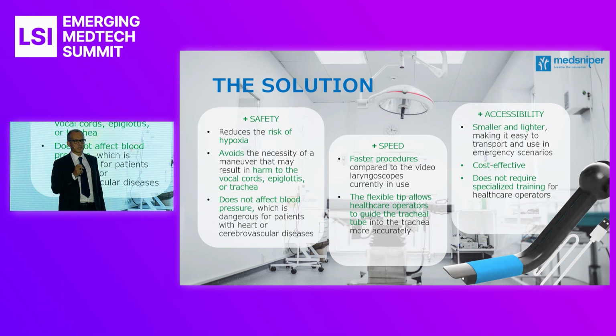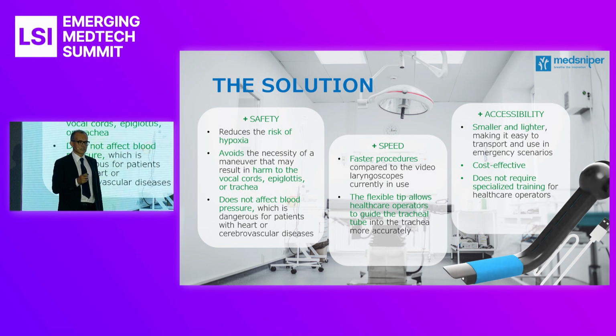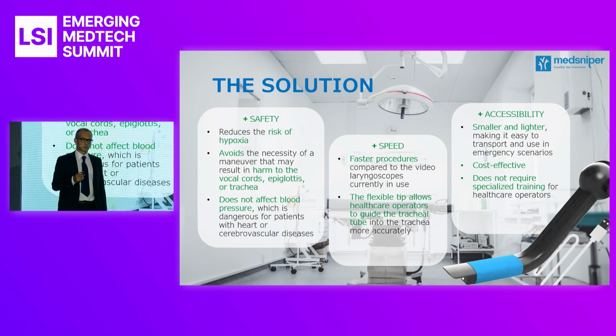Well, another important part of the problem was that when someone makes an intubation inside an operating room, an anesthesiologist like me is highly skilled and is in a quiet situation. But that is incredibly different when you're outside, in pre-hospital. You have an accident and you have a paramedic, a nurse, or a non-skilled doctor. And that's important because you know that a lowering of the rate of success at first attempt leads to hypoxemic damages to your brain. And so we wanted to have a solution.